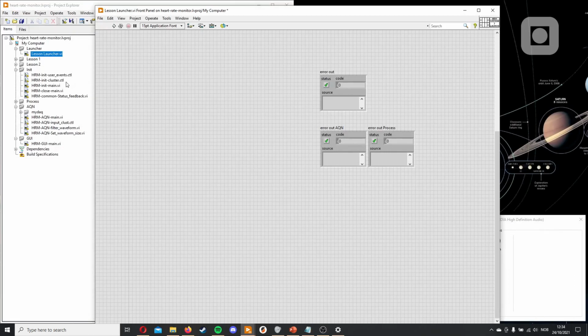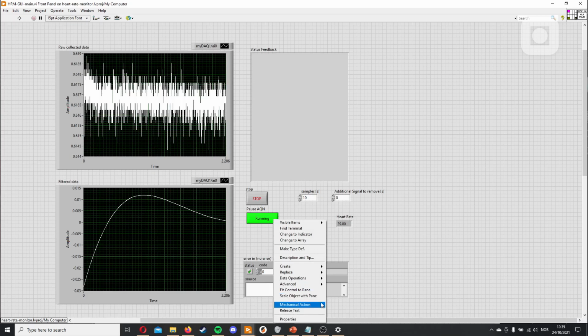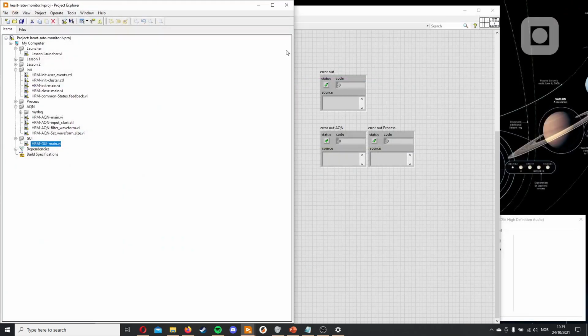This is because a lot of the buttons have this default action, which is latch when released, which means it automatically goes out again when it's read. This is a very handy feature for a lot of applications, but we want it to be in when it's in and out when it's out. So I change it to switch when pressed, so it only changes position when it's pressed.